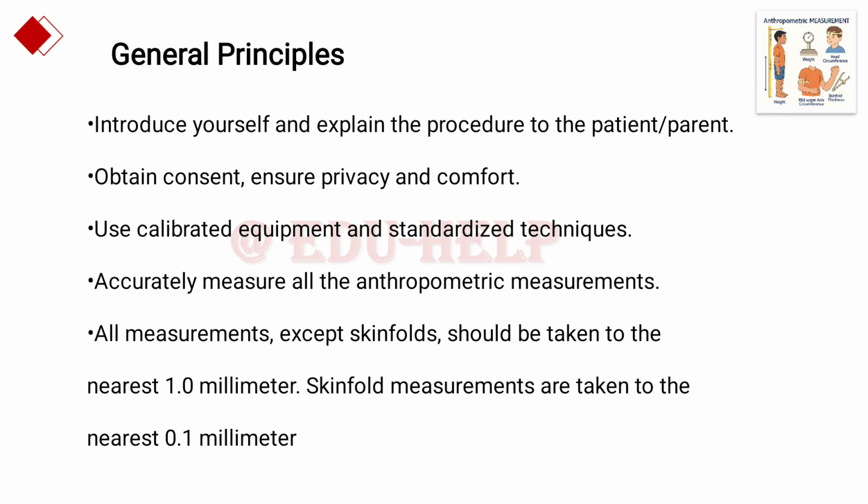Always use calibrated equipment and standardized technique, and all the measurements should be done accurately. All measurements except skin fold thickness should be taken to the nearest 1 mm, but skin fold thickness is taken to the nearest 0.1 mm.